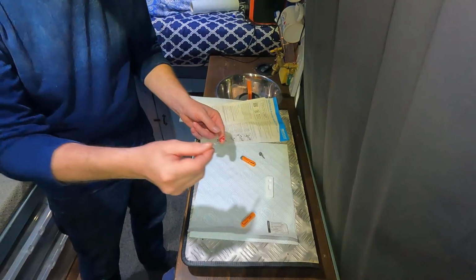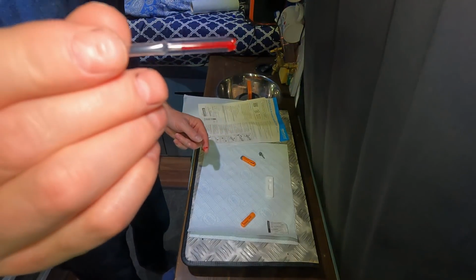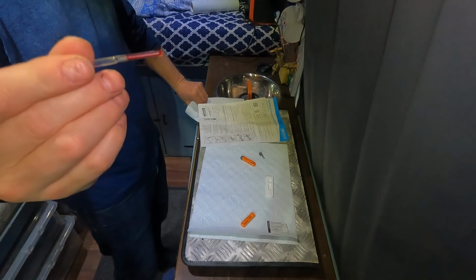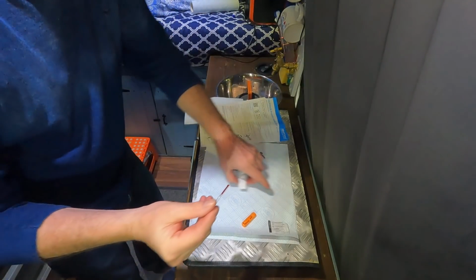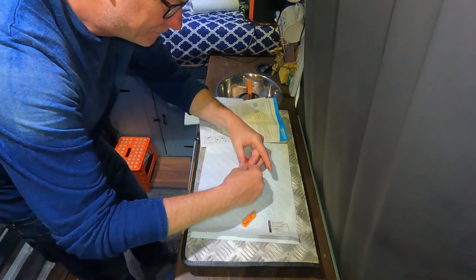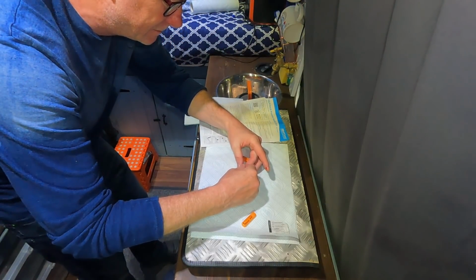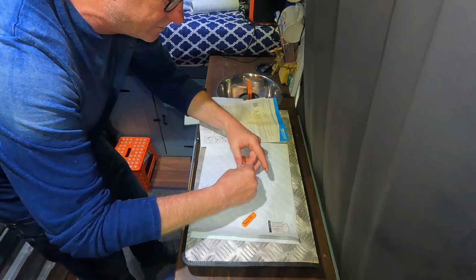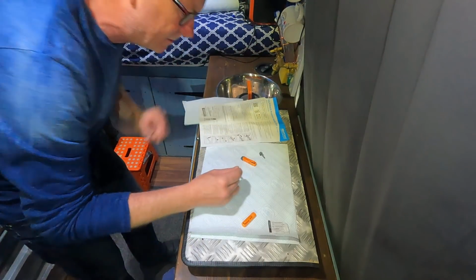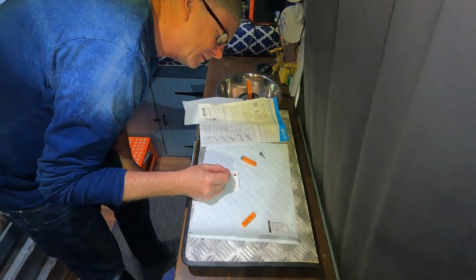Right, there you go. So this is now full of blood. It does say don't get any bubbles in it, but I've got one bubble in there. So, oh well. Right, so now my blood sample's got to go into this little tray. Got a bubble, it says no bubbles.